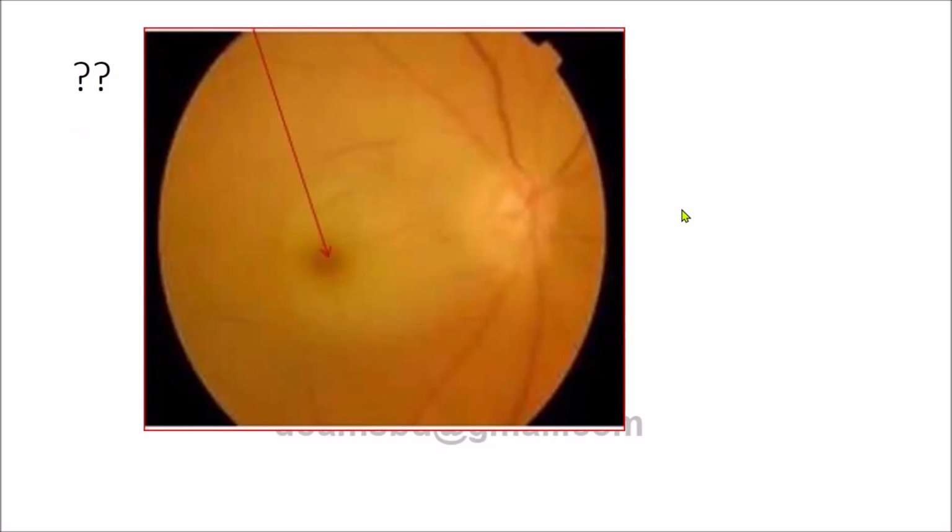In the retina you have to be very confident, and in a comparative mind, judge whether the background color of the retina is white, black, or other. Otherwise you cannot identify it. It could be white or more. It could be a milky retina, too much white, even more than this white.